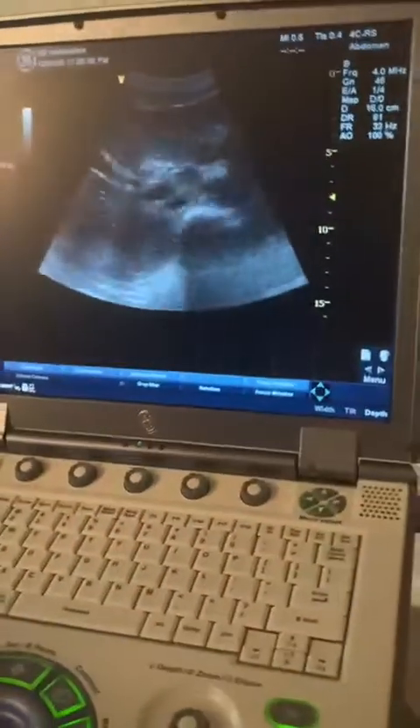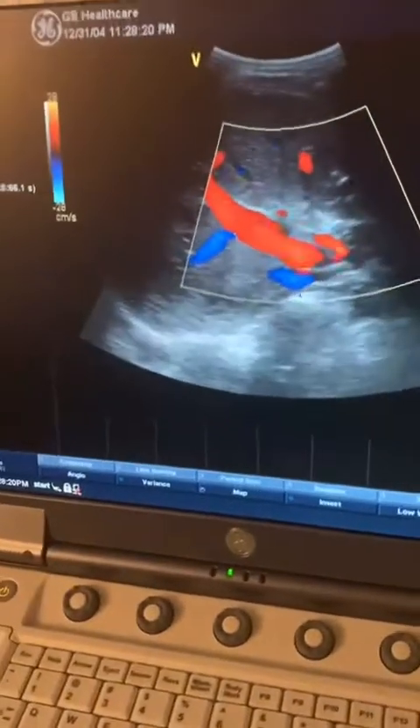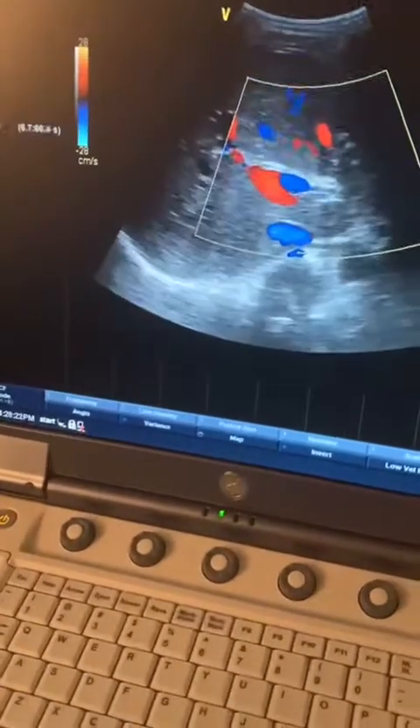Another vessel you want to look at when doing this exam — again, I love to go in between the ribs to get my images. The reason I like to do that is you can be very nicely parallel to the vessel when getting your waveform. In this case, I'm working on the hepatic artery.